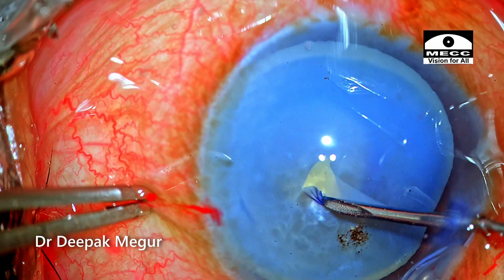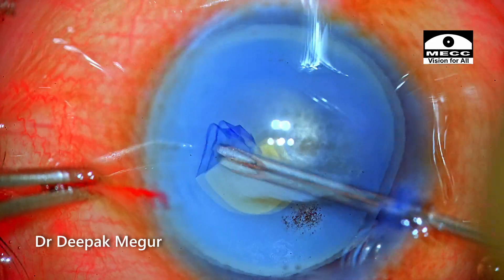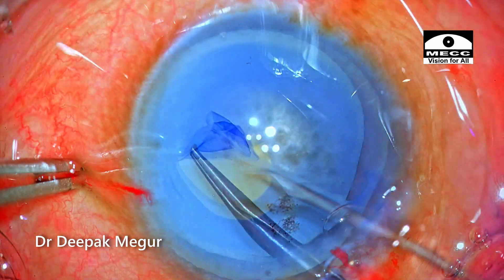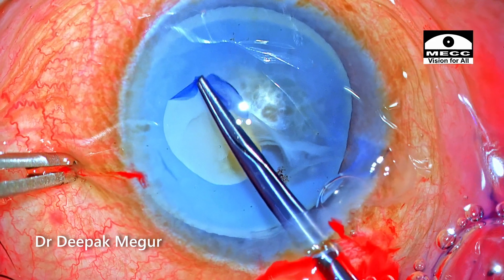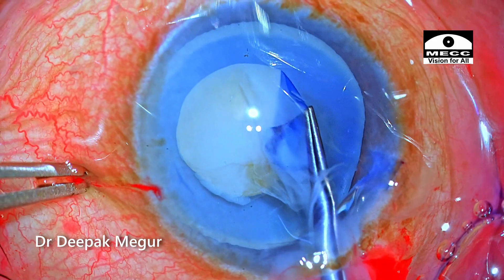The anterior capsule is punctured with a 26-gauge needle and then the rest of the capsulotomy is being performed with the forceps. The milky cortex escapes out a little bit, hampering visualization slightly, but it's not so bad.